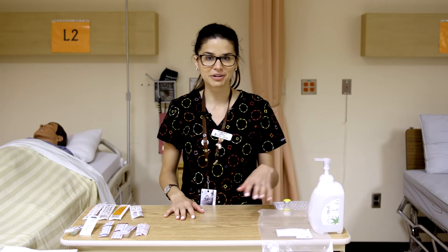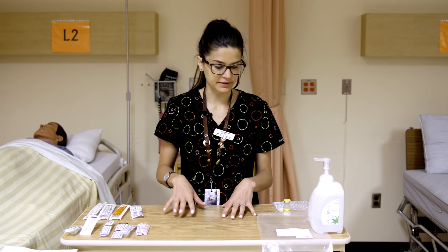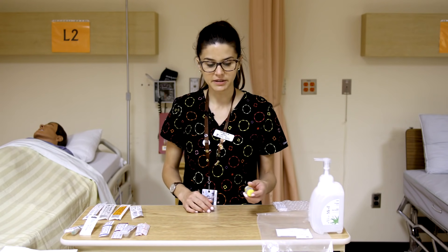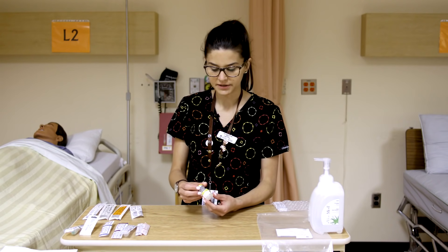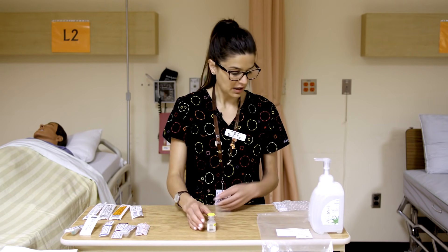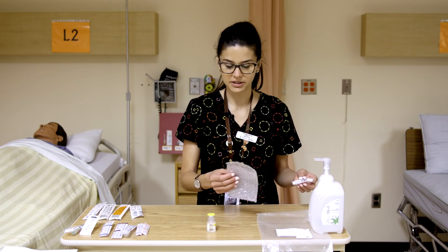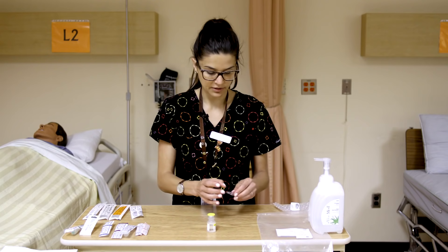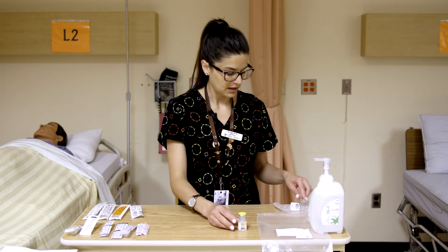Today I'm going to be going over the contents of your amps and vials kits and some of the basics surrounding amps and vials, and your different needles and syringes. The best place to start is with a vial. This is an example of a vial — it's just 0.9% normal saline, sterile with the top still on. And this is an ampule — they come packaged in bubble wrap because they are glass and you don't want those to break.